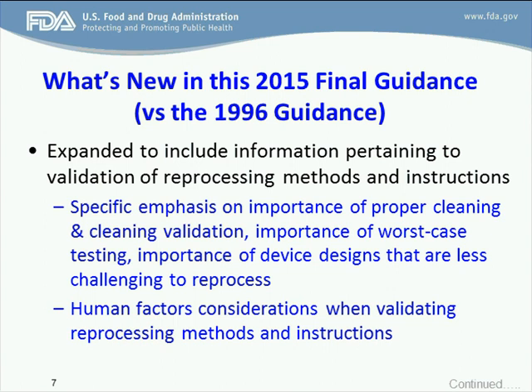Recommendations are also provided for proper validation of cleaning methods as well as instructions for cleaning. This document also emphasizes the importance of device designs that are less challenging to reprocess. And it also provides recommendations on human factors considerations that are important when validating reprocessing methods and instructions.